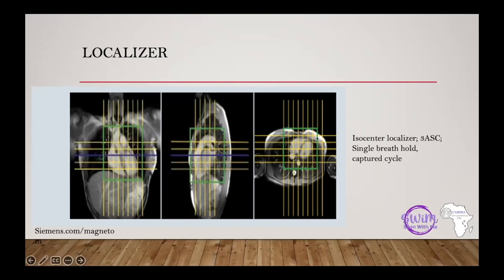You can see this green box. There's something they call shimming in cardiac MRI. Now, because the heart is constantly in motion, and generally motion in radiography tends to cause blurring of the image, it also applies to cardiac MRI. When you are scanning a patient, you should be able to, two things I need to state here before I go forward. I'm looking at my time, don't worry.